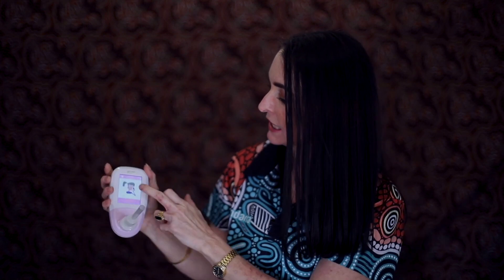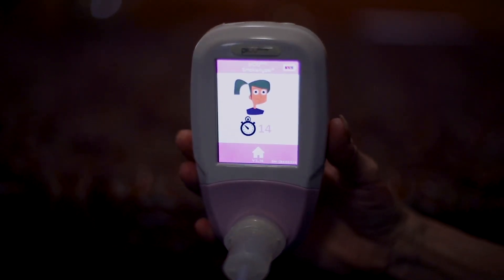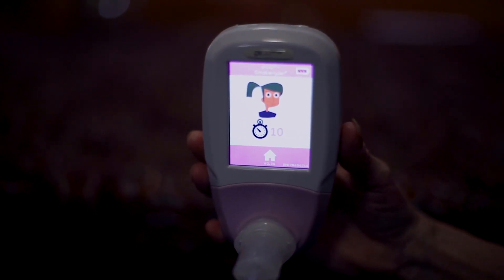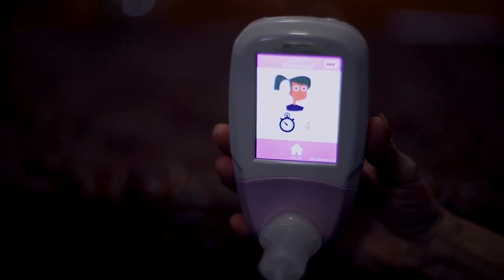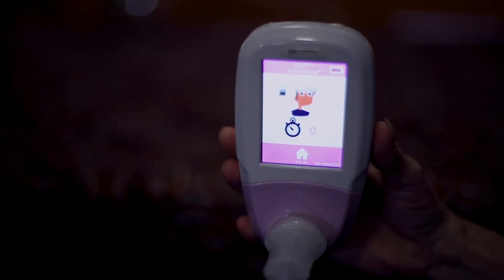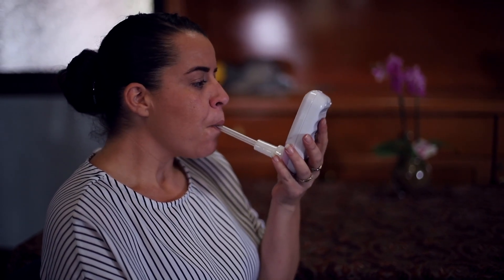After the machine is turned on, we press the button, which then indicates that the patient needs to hold their breath. They hold their breath for 15 seconds, and once the counter counts down you can give the machine to the patient to look at the time, as they can get a bit worried about holding their breath for that length of time. The machine then tells them to blow through the straw, emptying the air from their lungs.